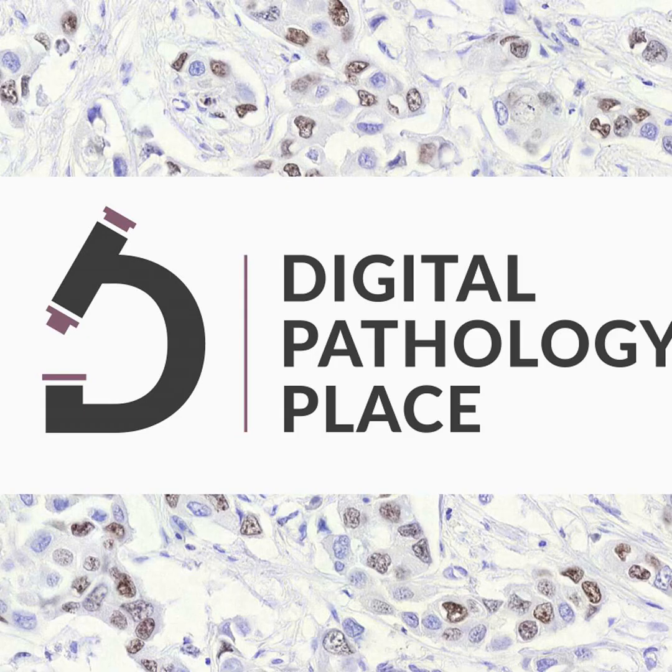The pleasure is mine. One of the early applications of digital pathology was image analysis on IHC stained tissue samples to quantify IHC marker positive cells for research purposes. At the beginning, it was just single markers, brown cells that needed to be quantified. With time, more and more markers were used, and this application is still super important.